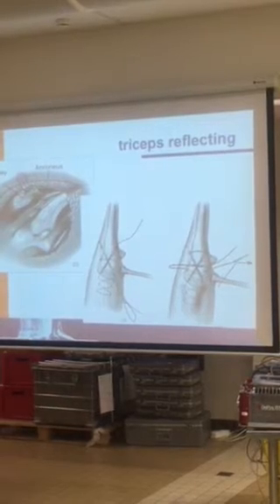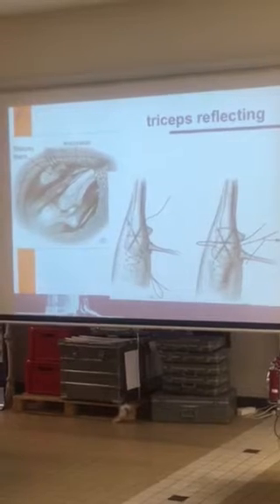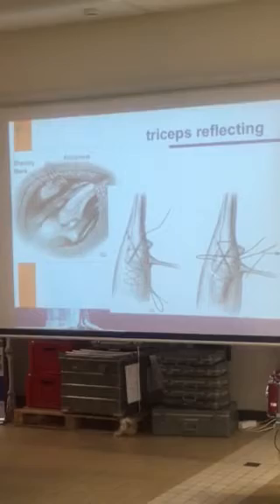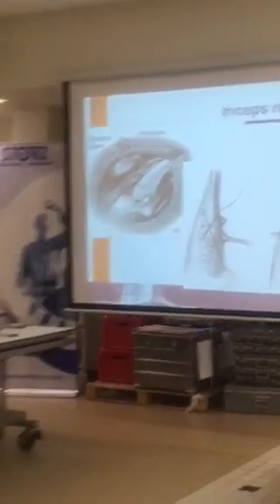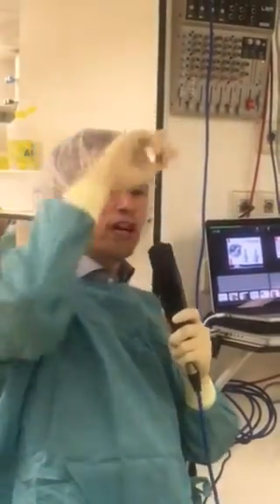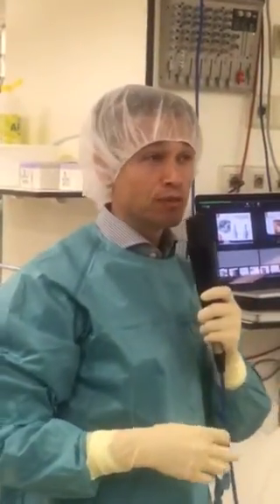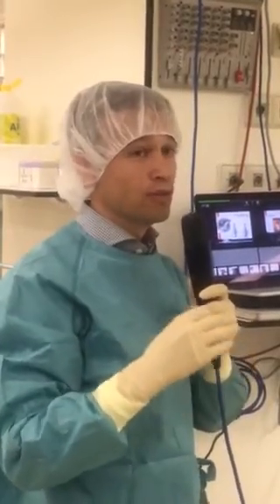Twice this has led to triceps necrosis. And if the patient has a problem with the triceps, they don't have problems carrying in normal daily life during the day. In the night, they get a problem. If you are lying on your back and you put your arm like that in your sleep and you have no triceps, the arm falls onto your head. So I have patients who are complaining about the lack of control of the triceps.